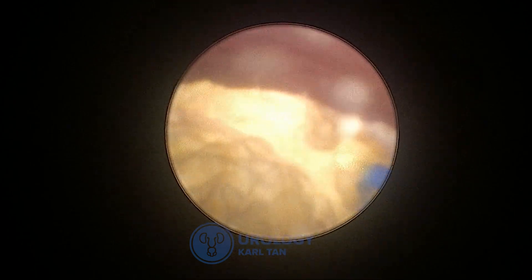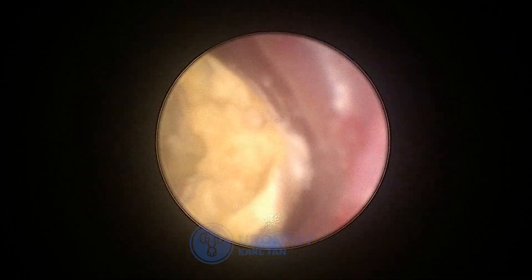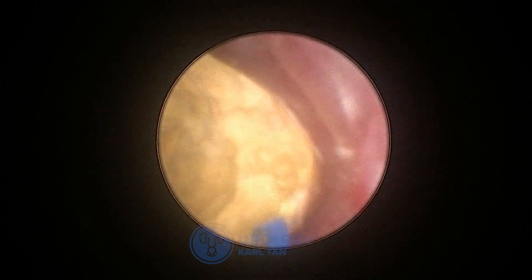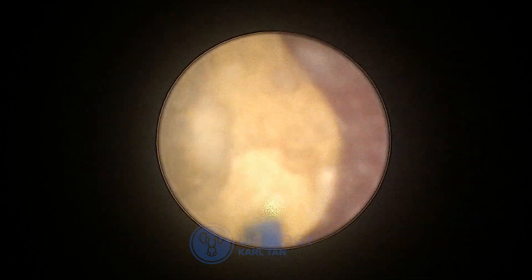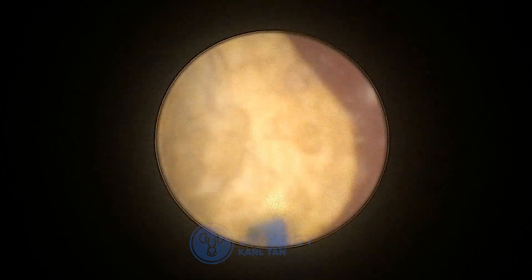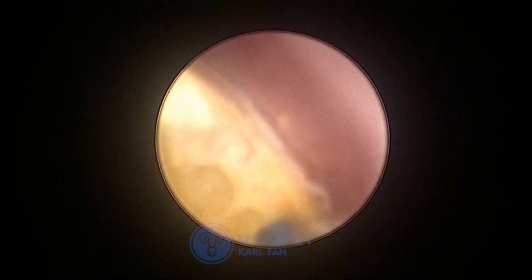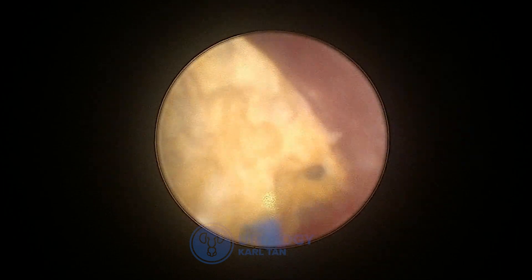Some surgeons do the coring until they can see through the stone all the way to the upper ureter. However, in this case it's a very big stone — actually a 1.6 centimeter stone. We decided to gradually start working on the sides after some coring, once we had enough space between the ureteral mucosa and the stone. We are lucky enough to be able to clear it out.